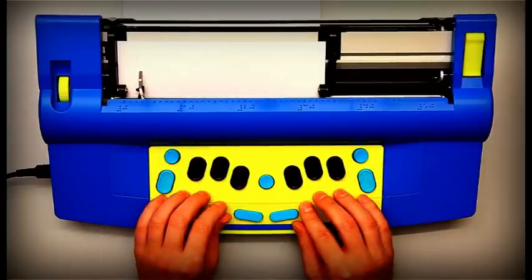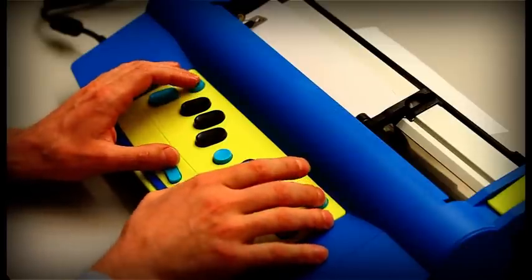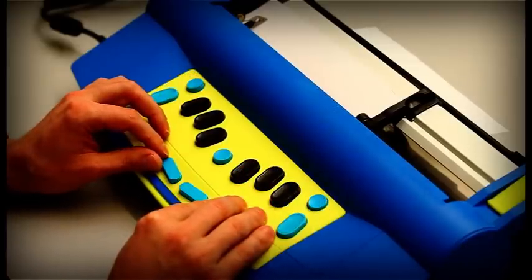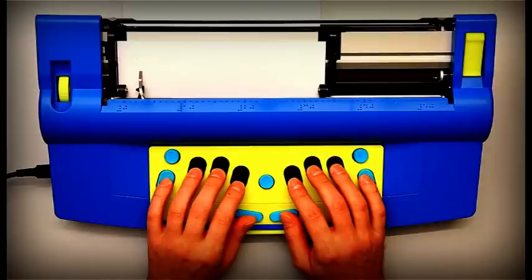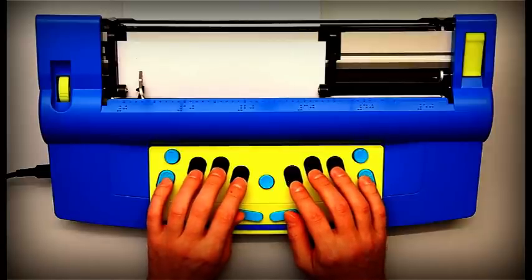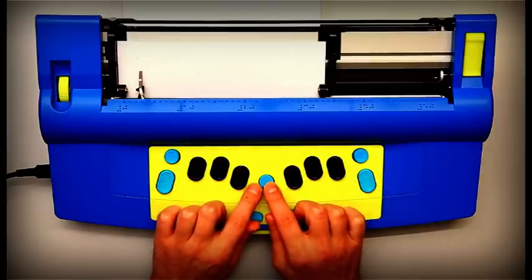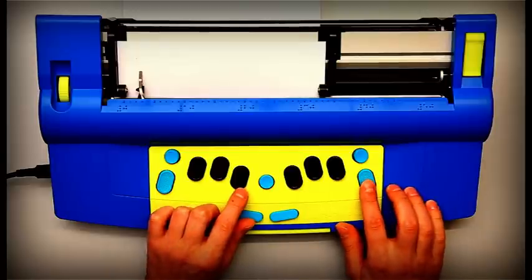When you activate the command key, you will hear the Mountbatten say 'command on.' This means you can now enter various commands. All regular commands begin with the command key and finish with the enter key with a command name in between.